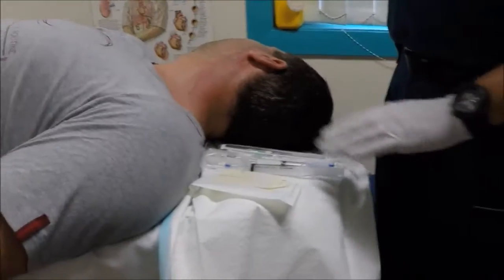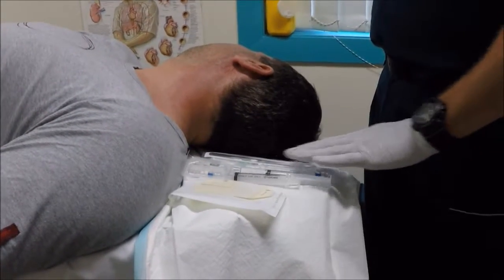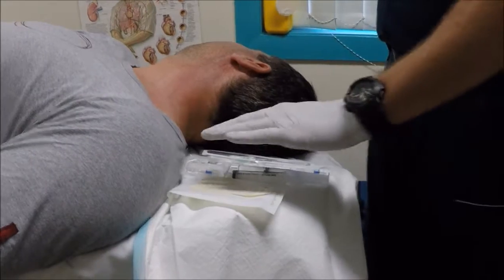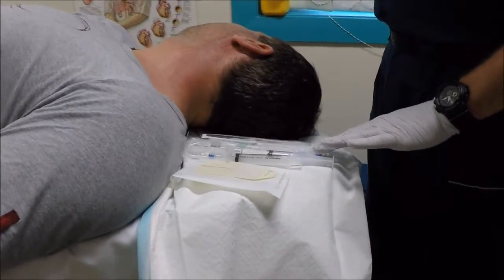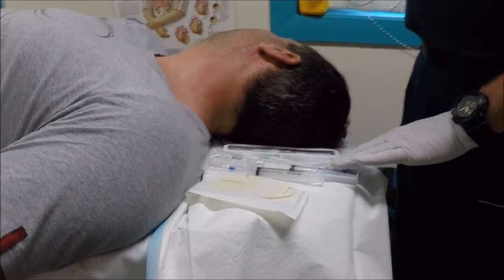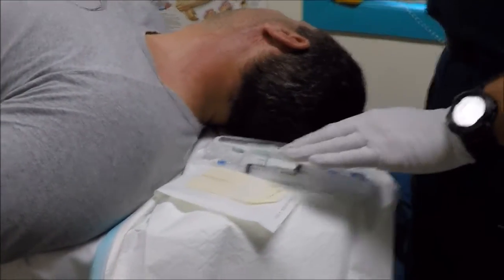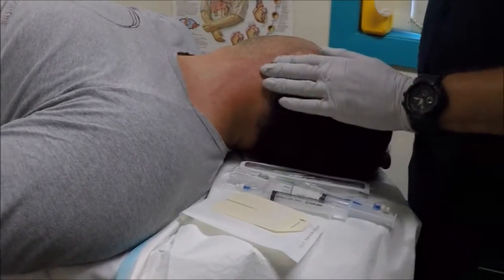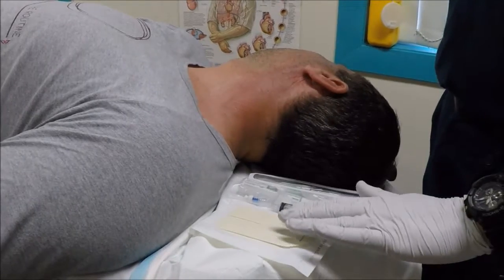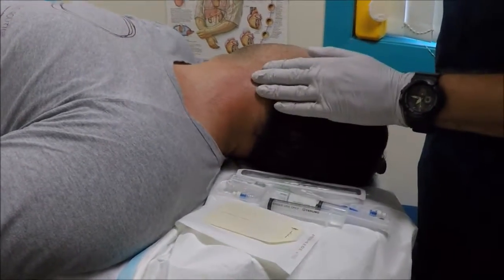So I've got all my gear laid out on a clean aseptic area. I've got my 18 gauge cannula, I've got a sterile bung, and a pre-flushed and pre-readied IV line. I've got a saline flush drawn up, and I've also got a second cannula that I can use to aspirate some blood if we were going to take some blood off this cannula. And I've got my Op-Site to secure it.